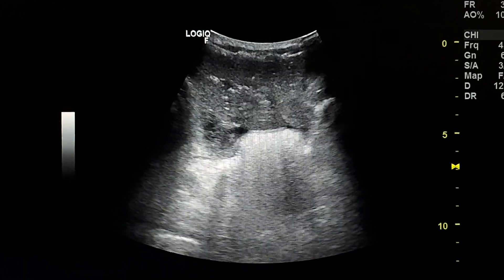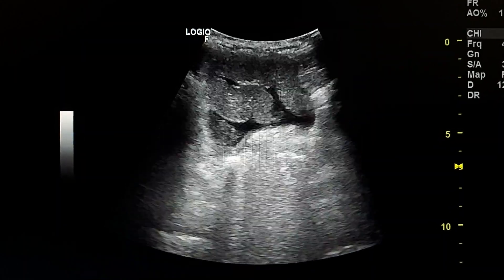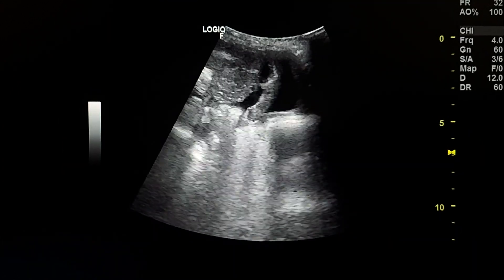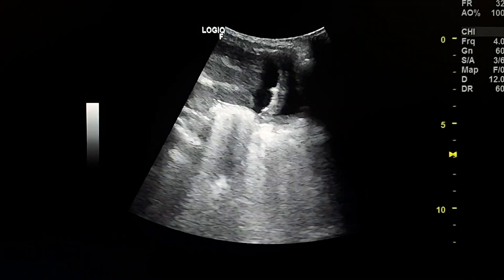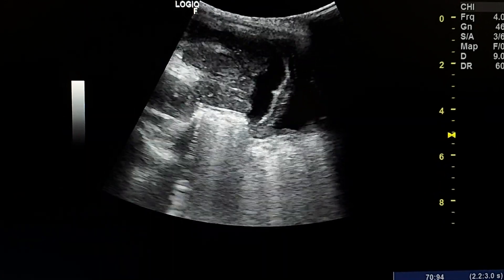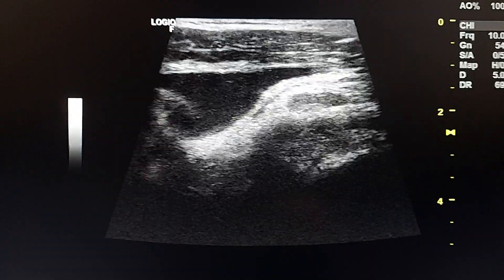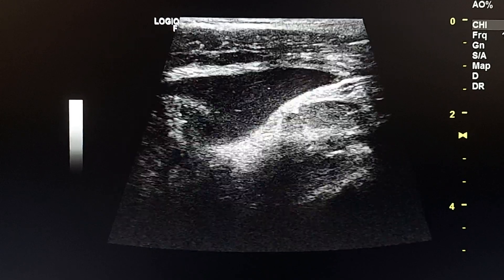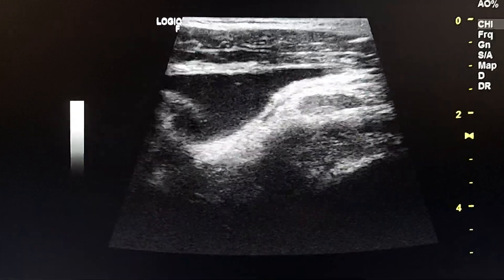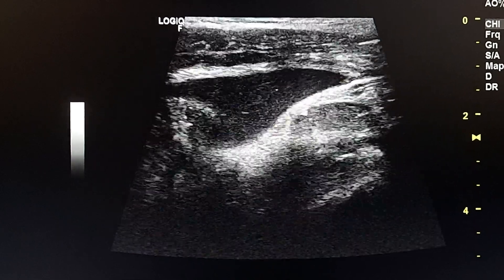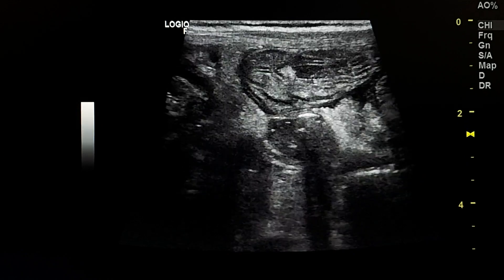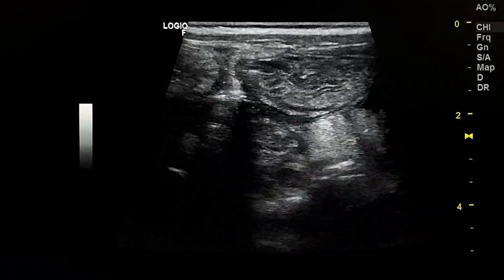This is an ultrasound case of a six-year-old male child with generalized abdominal pain for three days. Here in the pelvis, we see a small amount of free fluid. By linear probe, it was echogenic. We see internal particles inside the fluid. We also see echogenic fat all around.